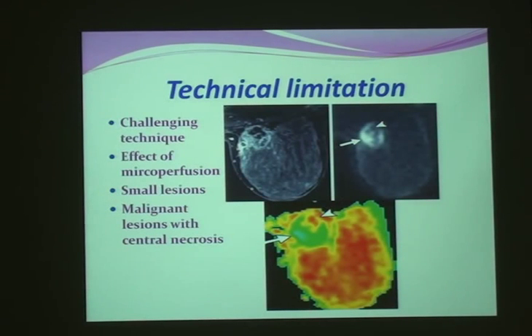Although it's promising, it's not really faultless. It has some technical limitations, of course. Some can be overcome, like the air surrounding, and others we are still doing our best to overcome, like the microperfusion. The ADC value is not just affected by the Brownian motion, but also by the microperfusion. So it makes the ADC value higher than it should be.